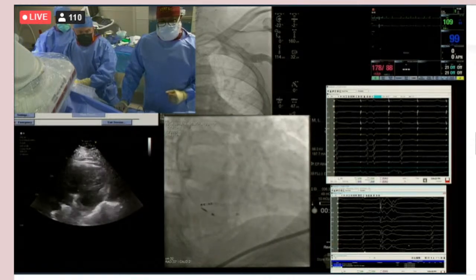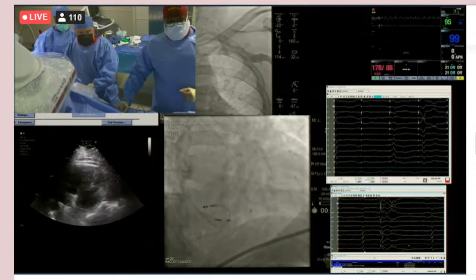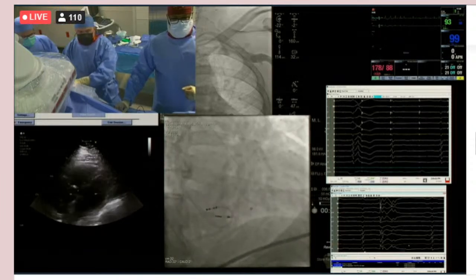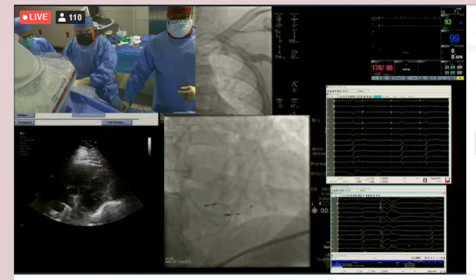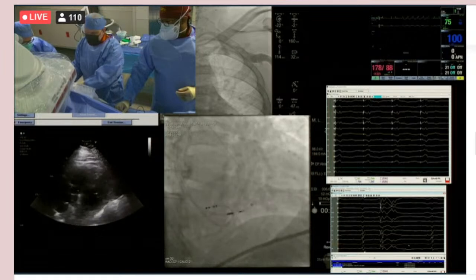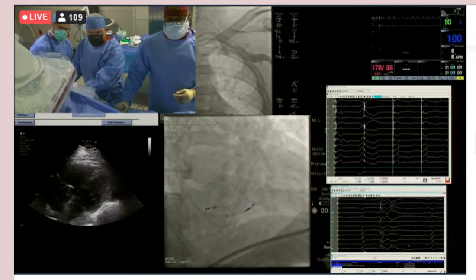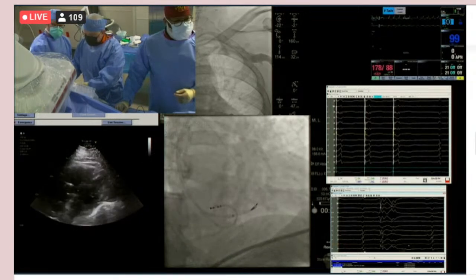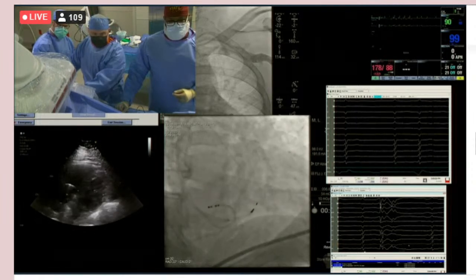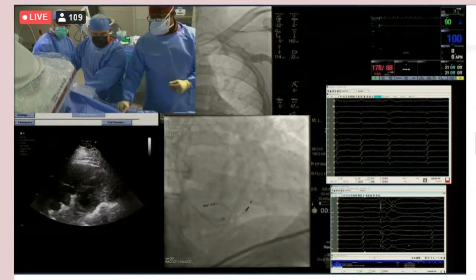I'm going to take a few more minutes to try and get a little bit better position. So there was a question about why you took out the lead, and I guess it was just checking to see if there's any tissue on it, and then also what he's been doing is putting it in some cold saline because it tends to be a little less noodly when that's the case. Yeah, that's exactly right. Both of those are true. If you have tissue on it, you may not realize it unless you see it. And if you have tissue, you may have a perfect location, but the tissue is preventing it from going in, and you can't quite understand why it's not going deep.